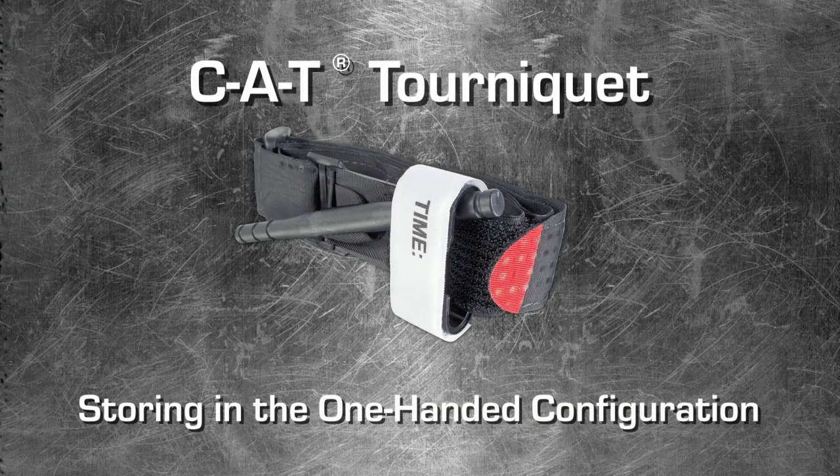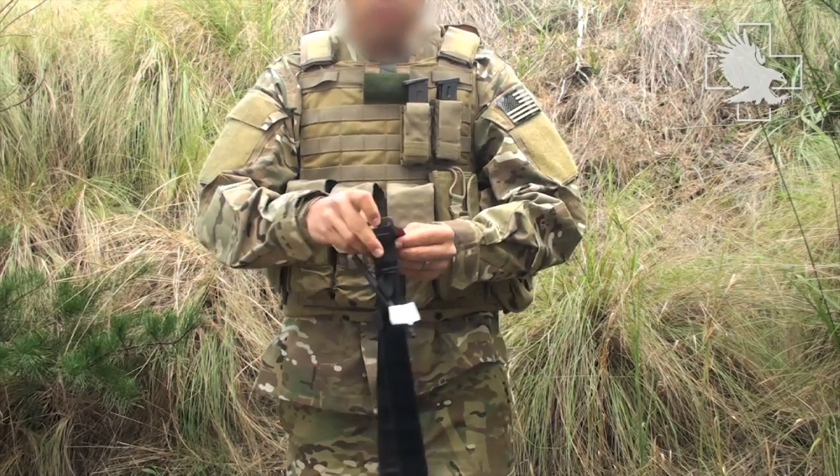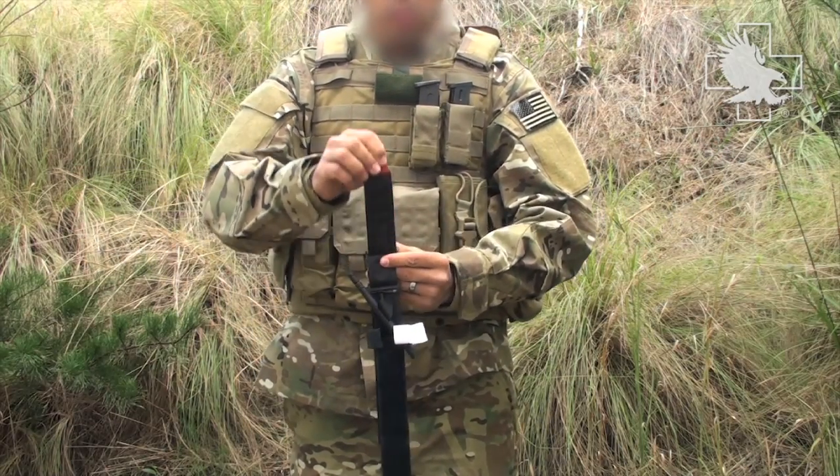Welcome to the CAT tourniquet video tutorial. Storage in the one-handed configuration. The CAT tourniquet is delivered in the one-handed configuration. This is the recommended storage configuration of the CAT.